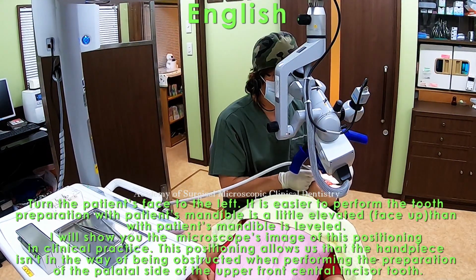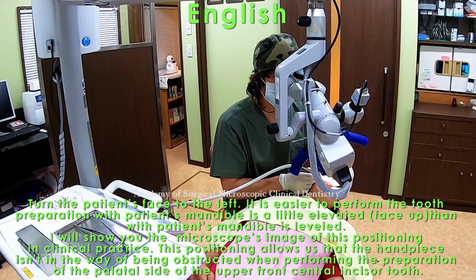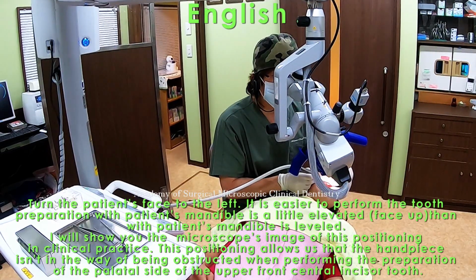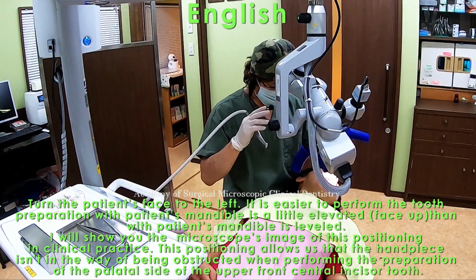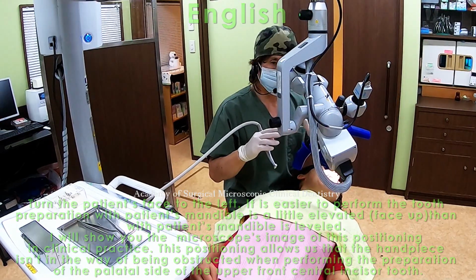I will show you the microscope's image of this positioning in clinical practice. This positioning allows the handpiece to not be in the way or obstructed when performing the preparation of the palatal side of the upper front central incisor tooth.